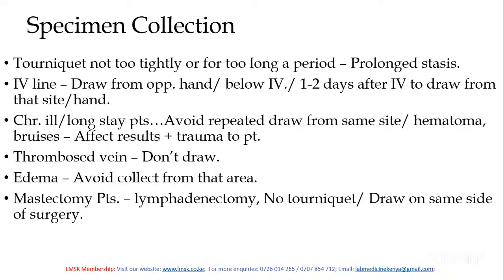Then you avoid a thrombosed vein. You avoid the hand or a limb which has edema.